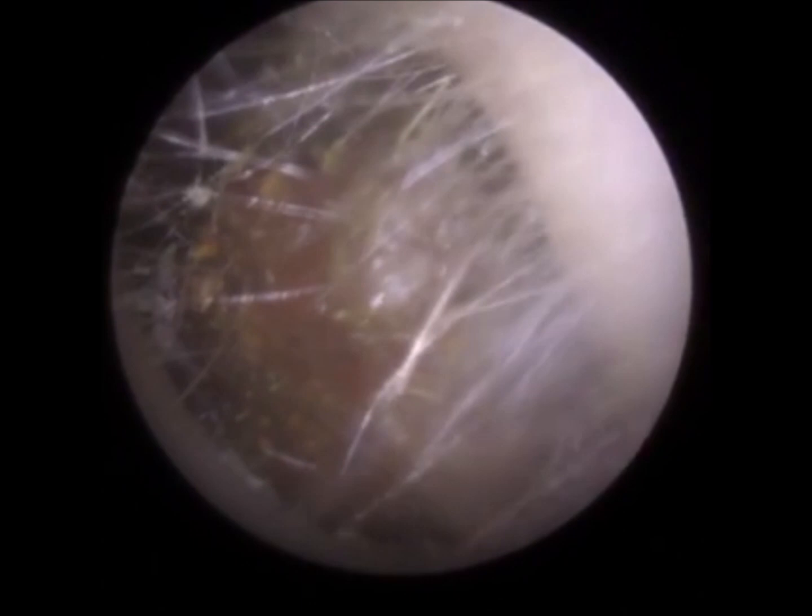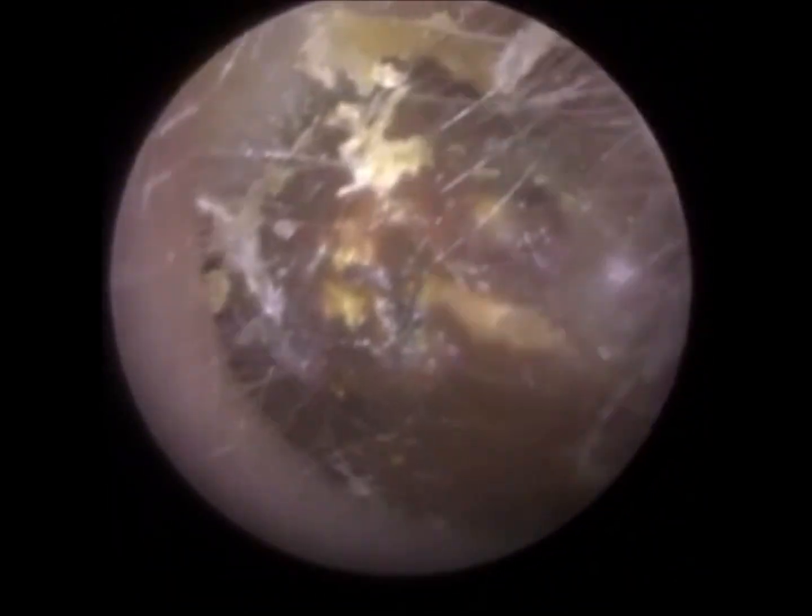This is a very challenging case in both ears actually. So we're starting off, and this is the patient's left ear, and this piece of wax that I'm removing using an ear hook is probably the hardest single piece of earwax I've ever removed. The ear hook itself was almost about to snap. It was that much pressure I was having to apply. It was that hard and that large near the entrance.